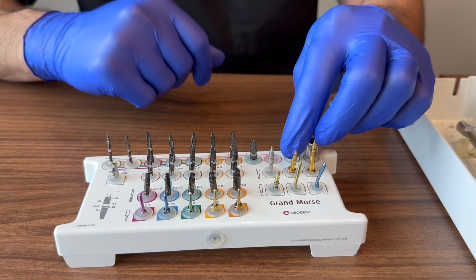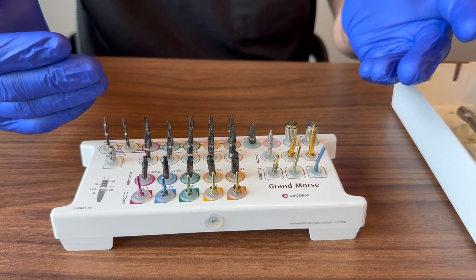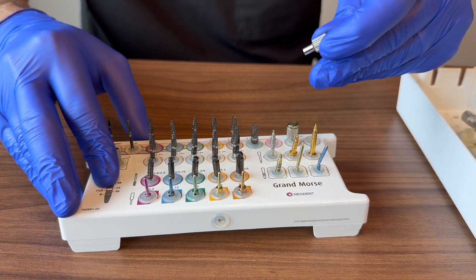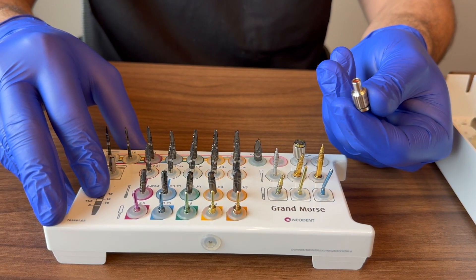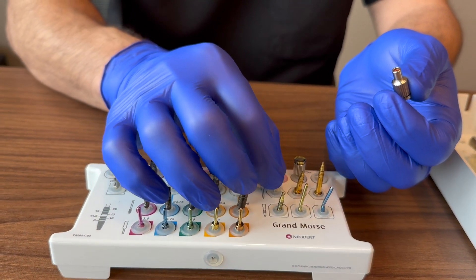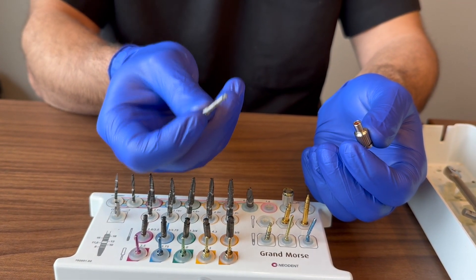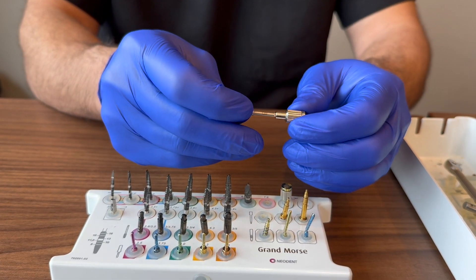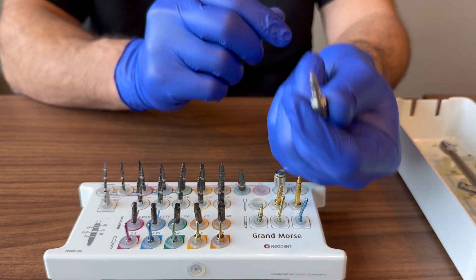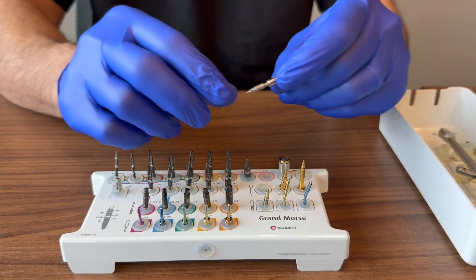Those are the main instruments for routine implant placement. There's also a converter in the kit — if you want to place the implant by hand, the latch attachment normally only goes to your handpiece, but inserting it into the converter and turning locks it snugly so you can grab the implant and place it by hand. It's optional — use whatever works best for you.